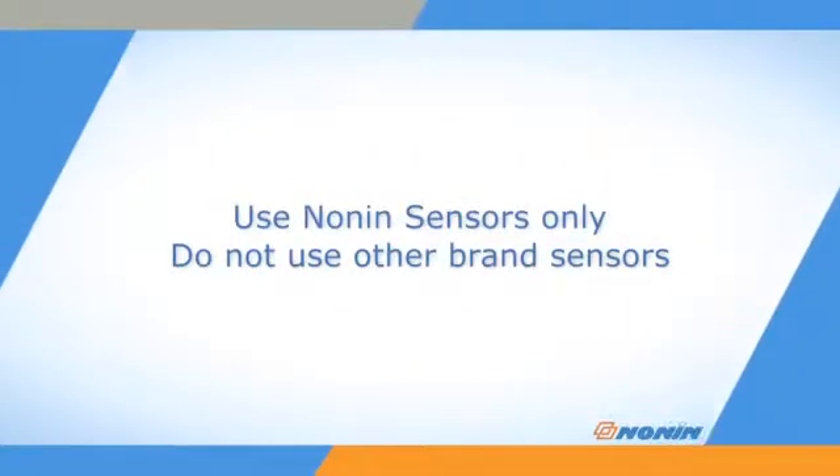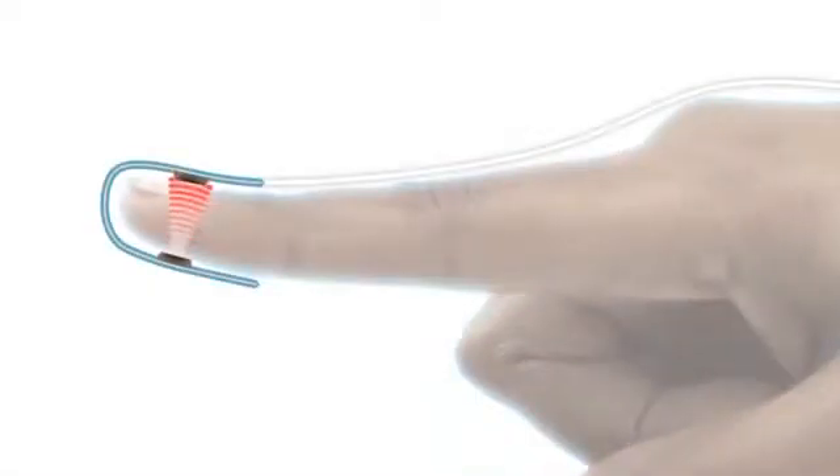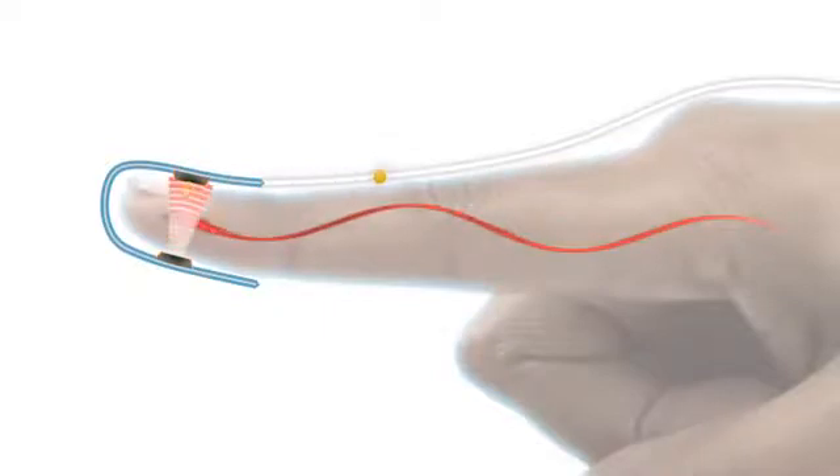Nonin pulse oximeters are designed for use with Nonin sensors only. Do not use these pulse oximeters with other brand sensors. Nonin sensors have an emitter that projects a tuned light wave pattern through the arterial blood and a detector which receives that light. Changes in the light wave spectrum during pulsation of blood generate a measure of blood oxygenation and pulse rate sent to the pulse oximeter.